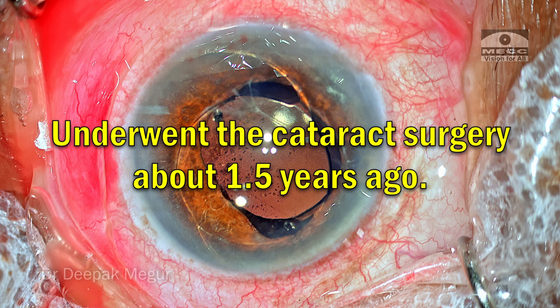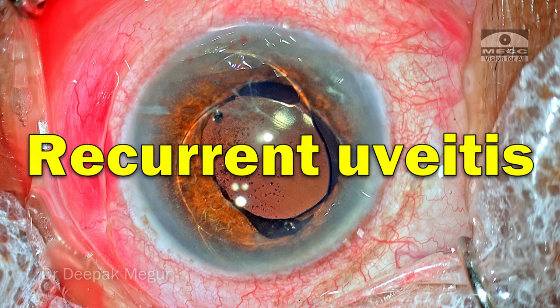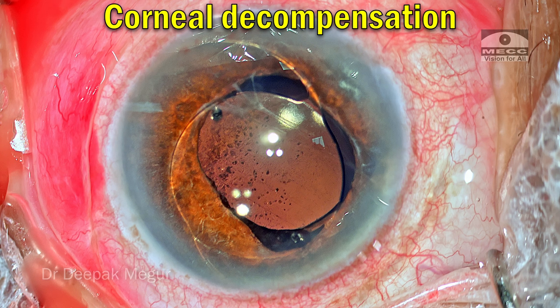She underwent surgery about one and a half years back and since then she's been very symptomatic. Vision is not good. She's suffering from recurrent episodes of uveitis. The pressures are all right so far, but there is a hint of corneal decompensation happening because of this haptic which is touching the endothelium.